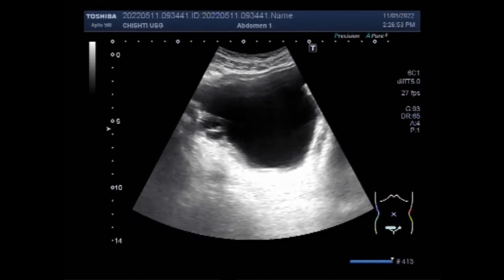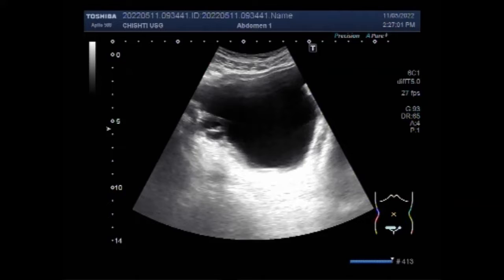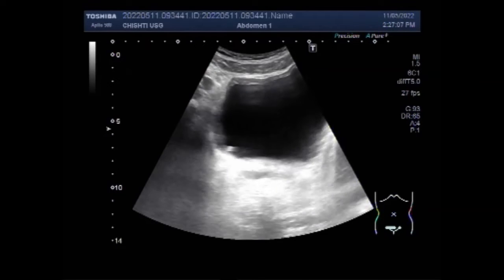Dear viewers, I hope you are all fine. This ultrasound video shows a case of trabeculated urinary bladder. Multiple trabeculations are seen along the walls of the urinary bladder.